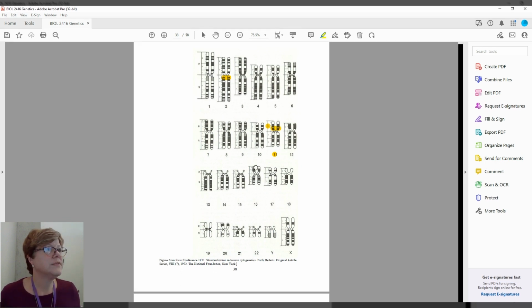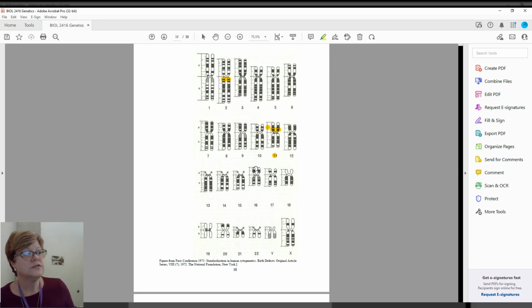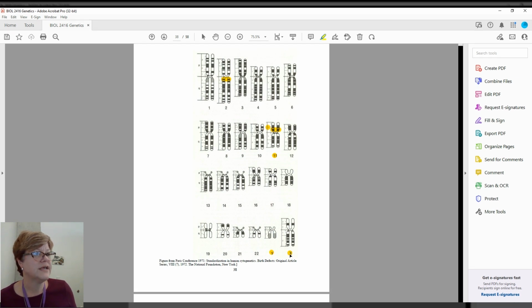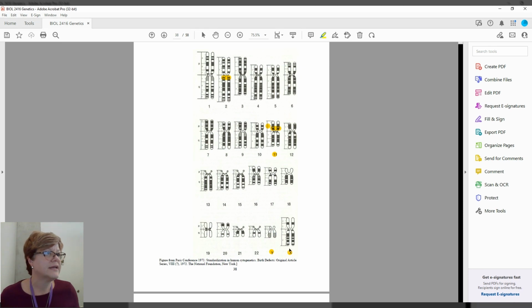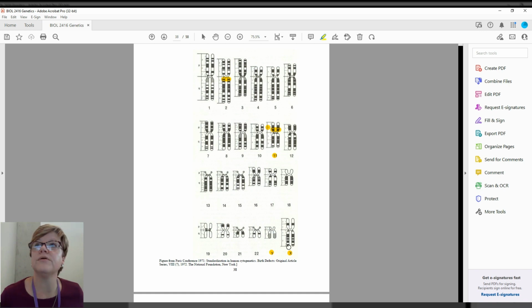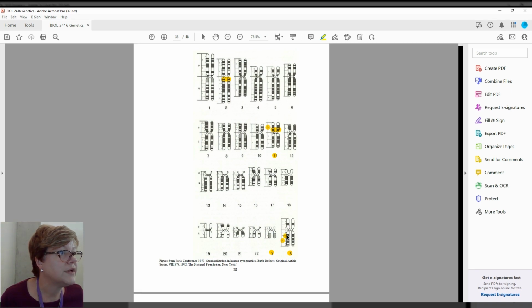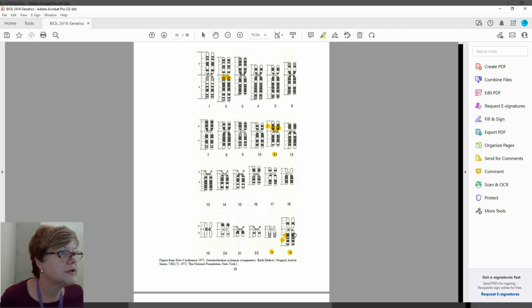And the last example I gave you is XQ21. So X here, and the same would be for Y if it was Y. X, we don't say 23, we say XQ, which would be the longer chromosome, 2, 1. So region 2, band 1 would be right here. So you'd be about right here, if you can see. Okay, so I put some pop-ups, some quiz poppers, so you can practice that.